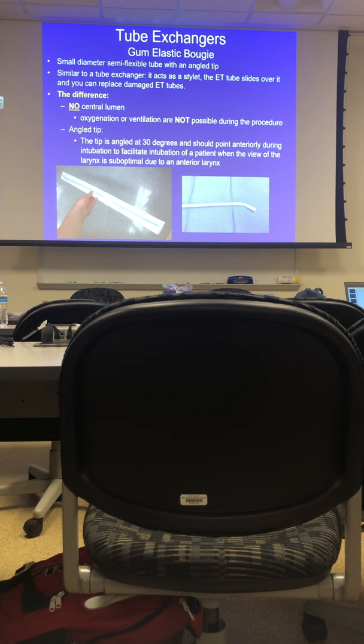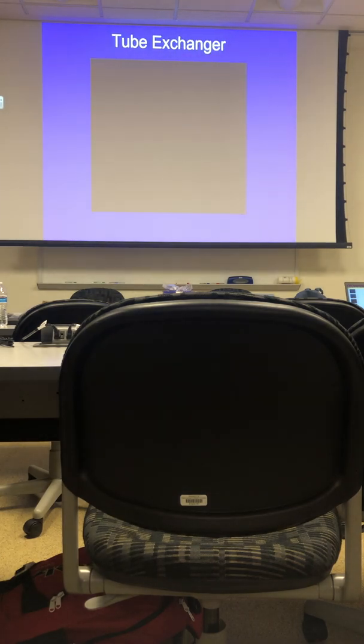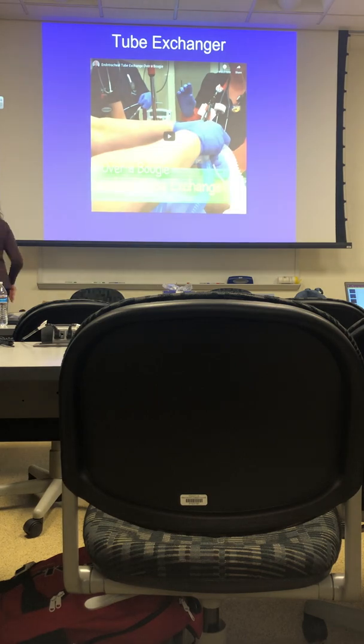Okay, thanks. All right, so this is the bougie. No central lumen, doesn't have a 15 millimeter adapter. You cannot ventilate through the bougie. Let's see, I got a little video. Let's check it out.